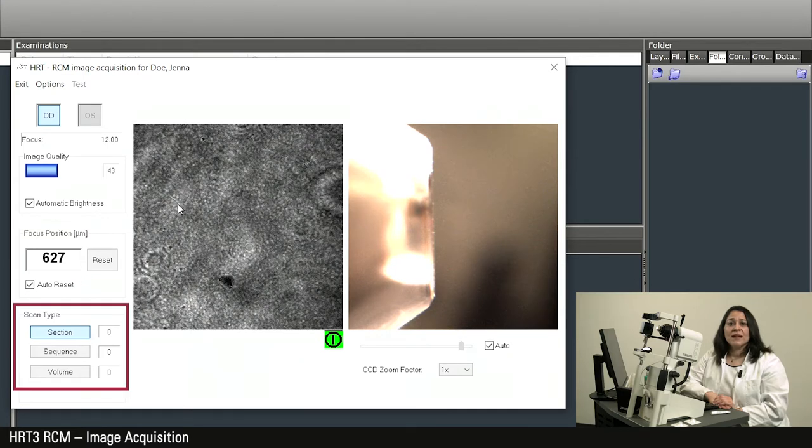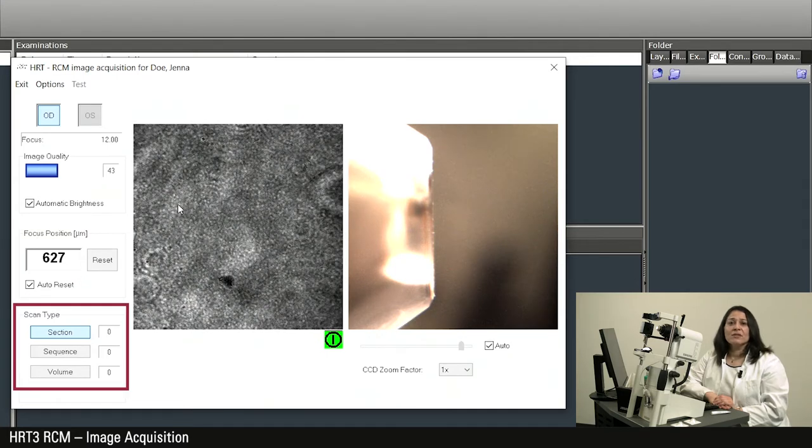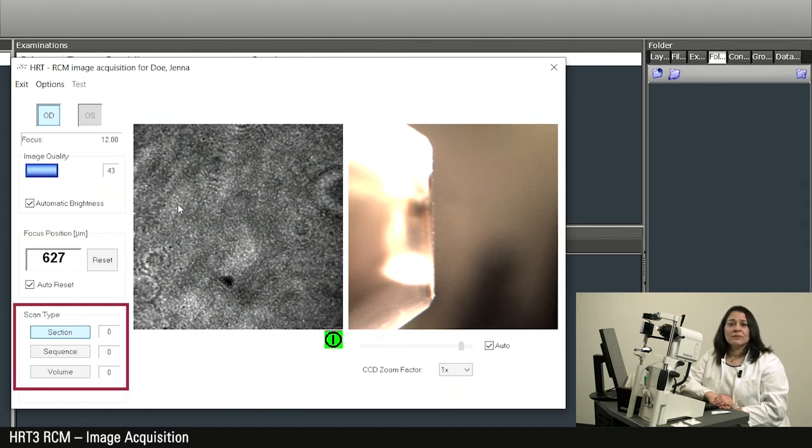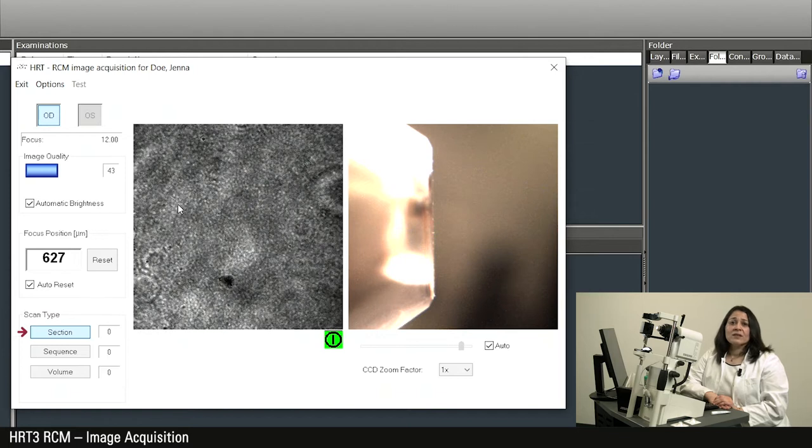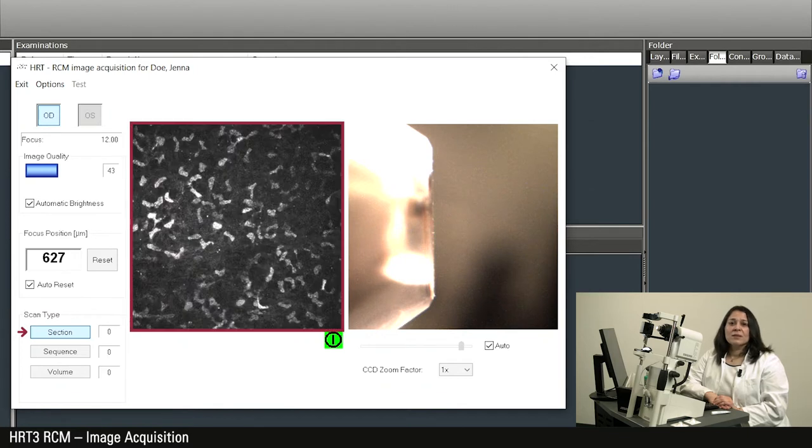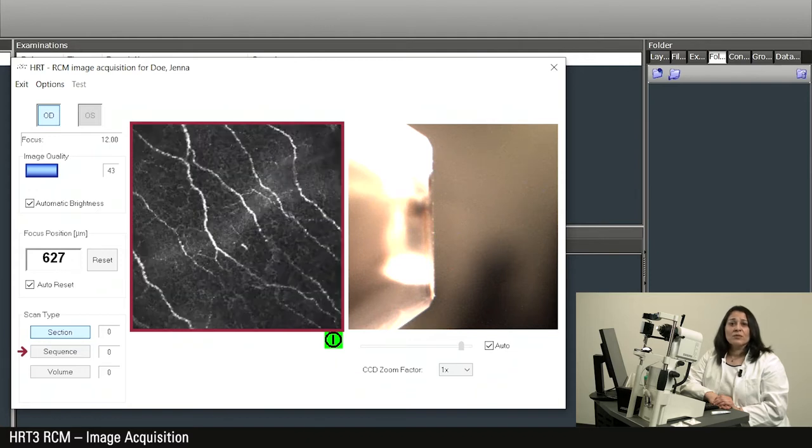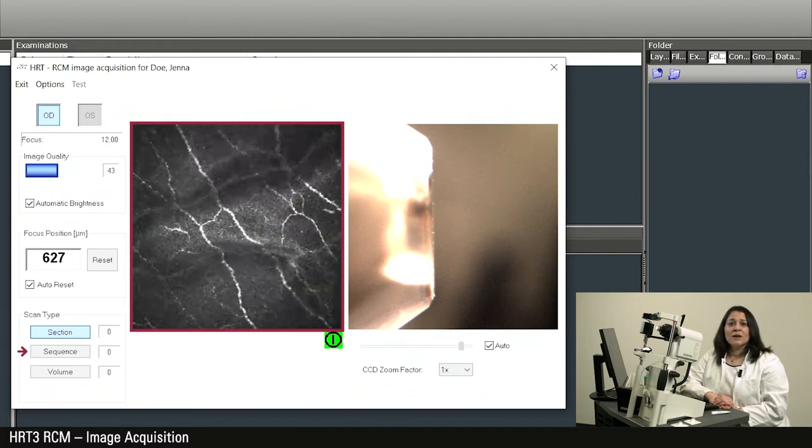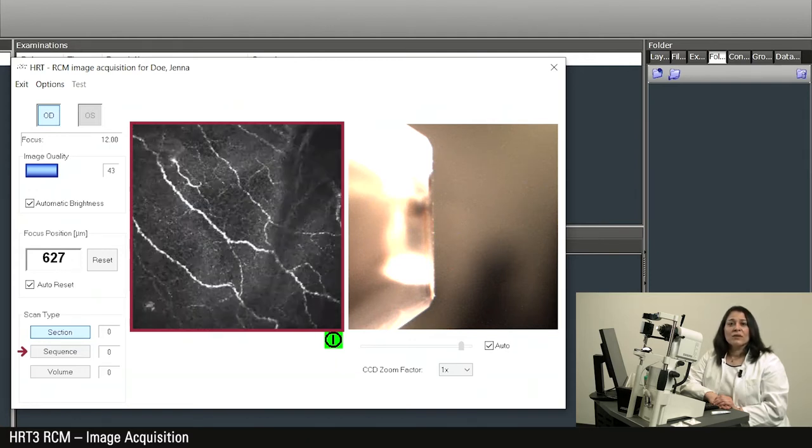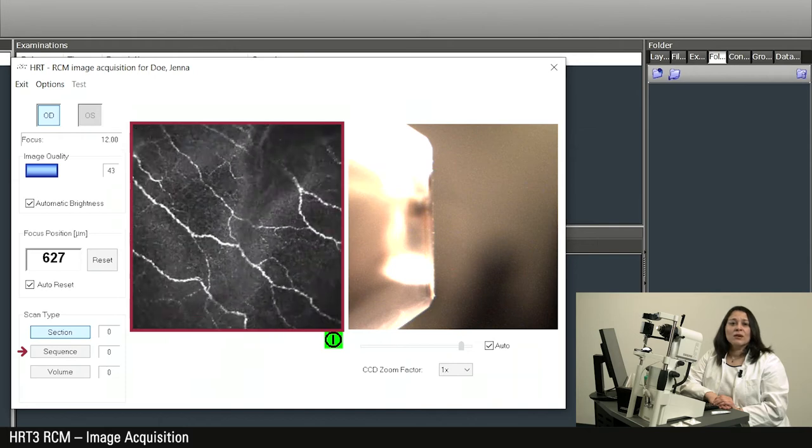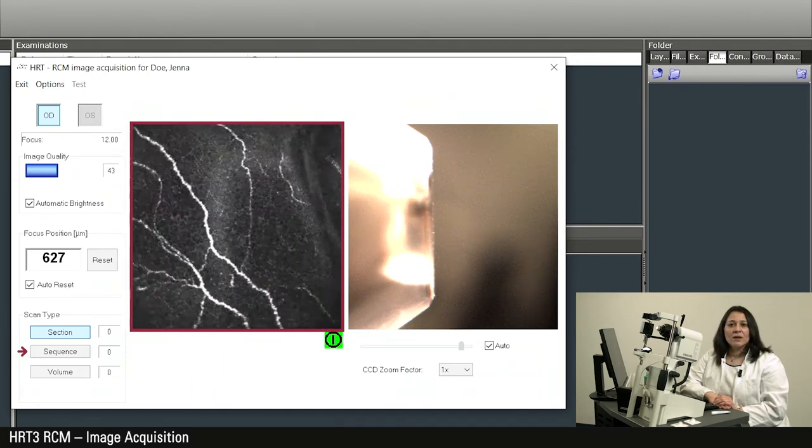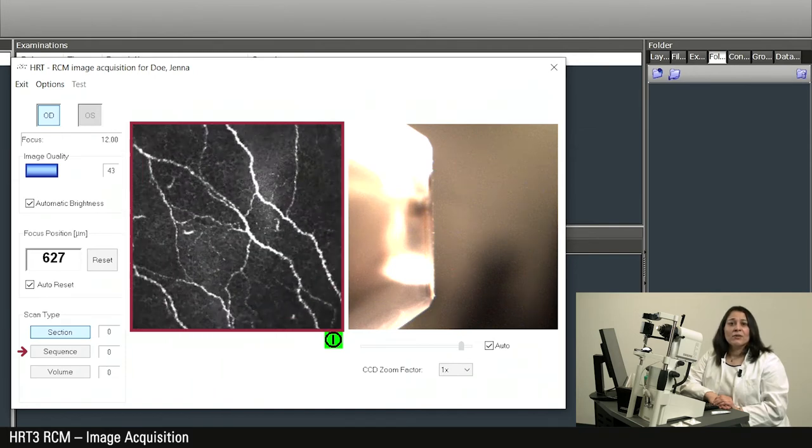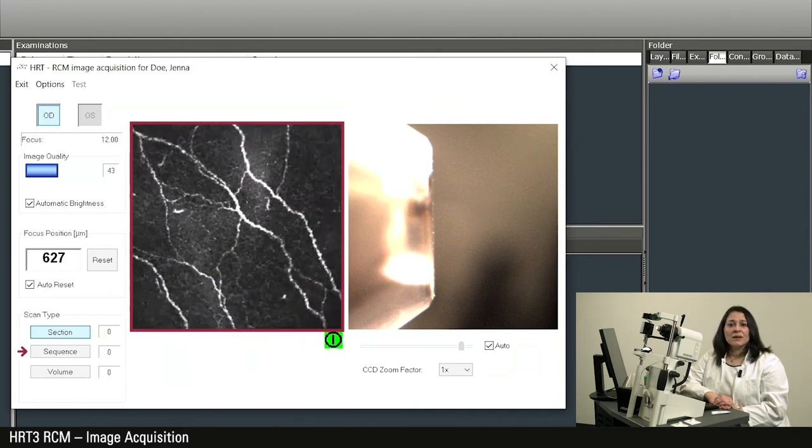The following scan types are available for acquisition. When section is selected, a single image is acquired and stored each time the acquisition button is pushed. If the sequence option is selected, a movie can be recorded with a variable number of up to 100 frames. The frame rate ranges between 1 and 30 frames per second.